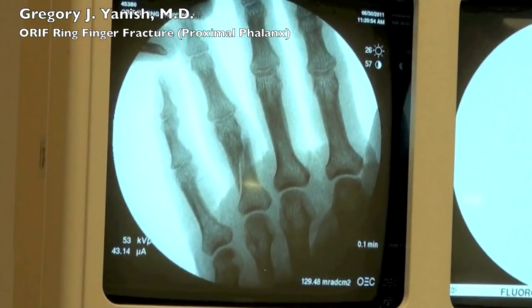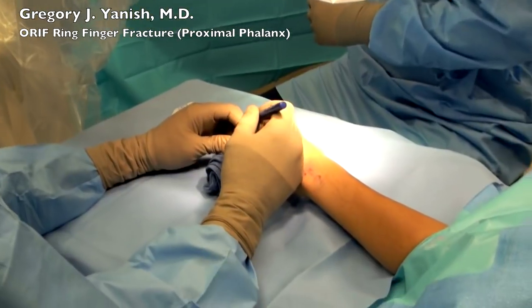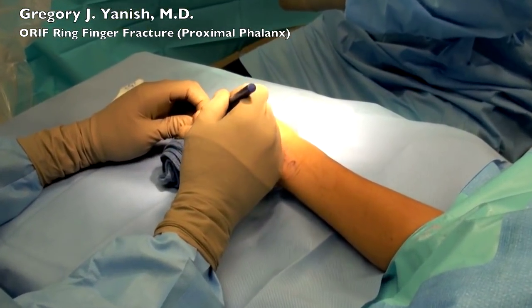This fracture is in the proximal phalanx and you can see that it's oblique. We're going to be marking the skin incision again with a skin marker.